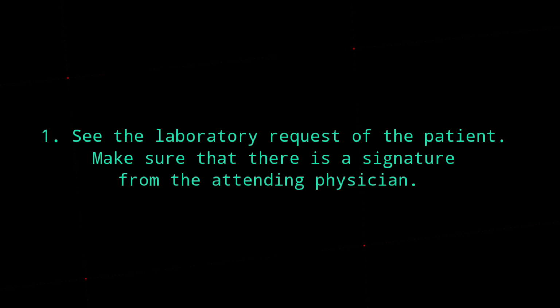First step is that the patient will give us the request. So we have to see the laboratory request of the patient, and we have to make sure that there is a signature from his or her attending physician. There are some examples of the laboratory request, and this one is a vacant laboratory request.